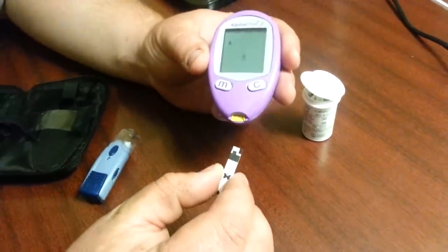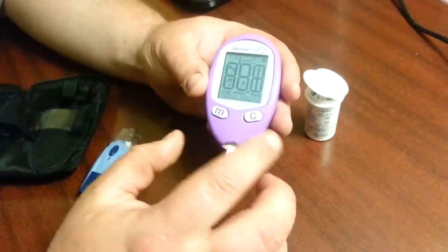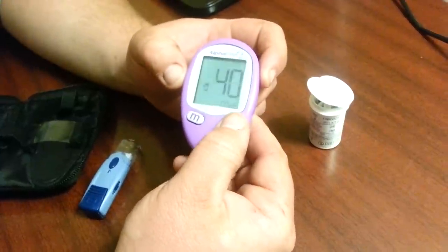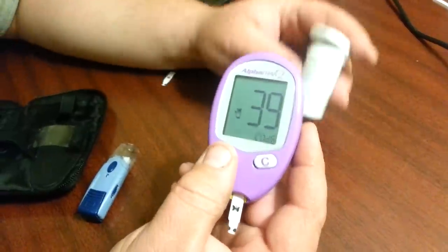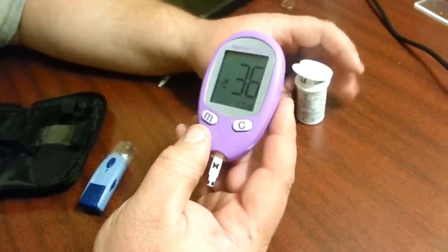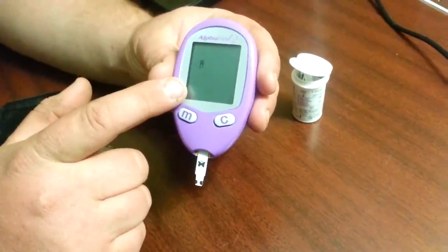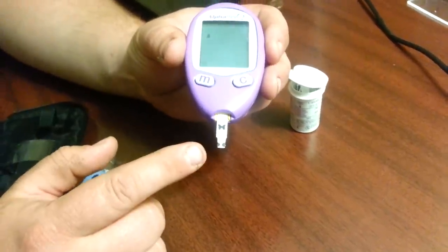Now if that code was different, when it flashes a code you want to make sure it's the right one. If it's not the right code, if you hit the C button the numbers will go up, and if you hit the M button the numbers will go down. This code was 36, so I'm going to set this to 36. Once you have it on 36, you just let go and you'll see a little flashing picture right here.